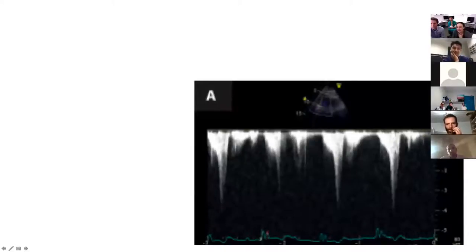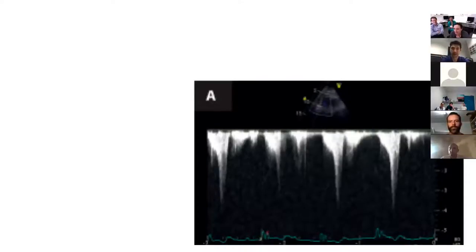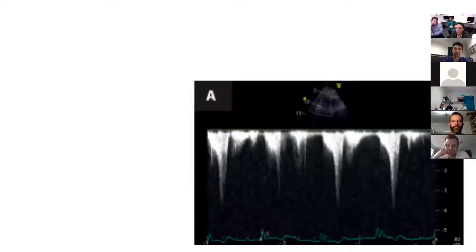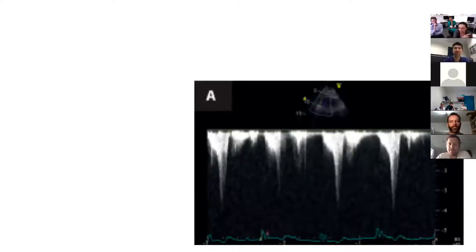Looking at continuous wave Doppler through the LVOT — this is a late-peaking spectral Doppler signal, which signifies obstruction along the path of the continuous wave, anywhere from the LVOT to the apex of the LV. The reason for the late peaking is a feedback loop: as gradients increase throughout the cycle, you get higher and higher pressures — that's why it peaks late.